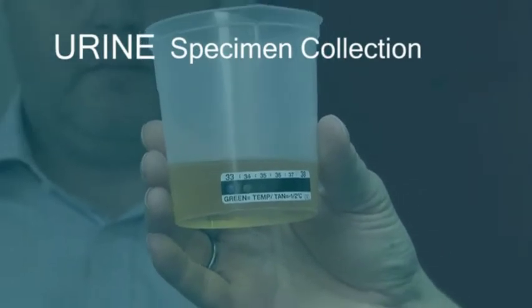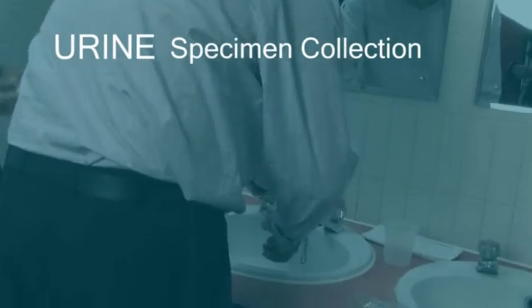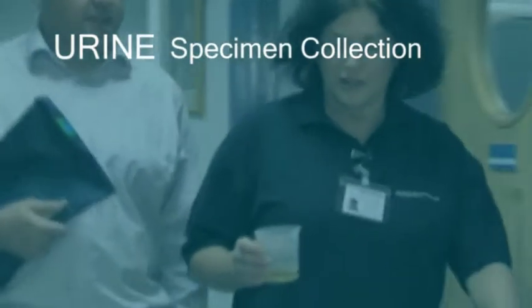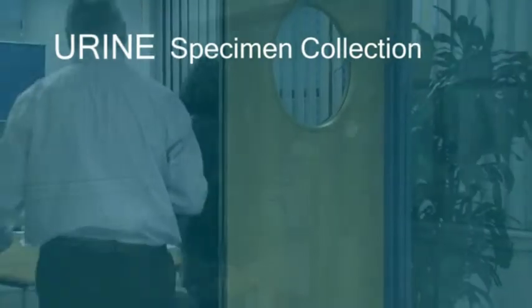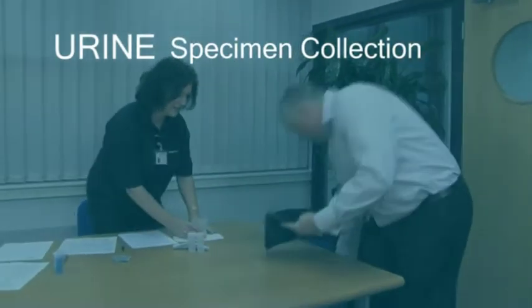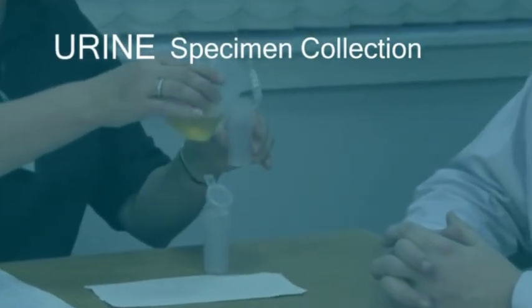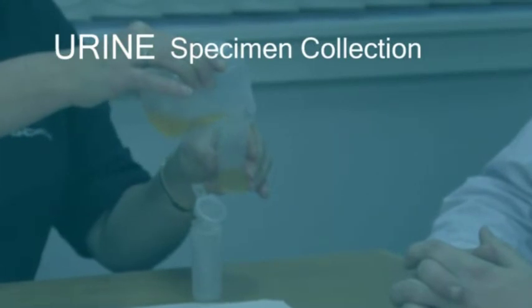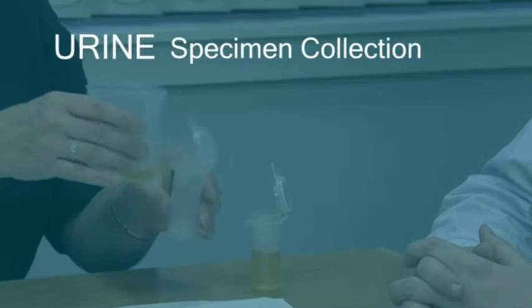Make sure that a colour change is registered. Allow the donor to wash their hands. Then, carrying the collection cup, return to the private room allocated, making sure that the cup is in sight of the donor at all times. Place the cup on a flat surface, and then, making sure you have the donor's attention, pour the urine from the cup into the bottles, so that each contains the same amount, and there is the required volume in each bottle, as indicated.